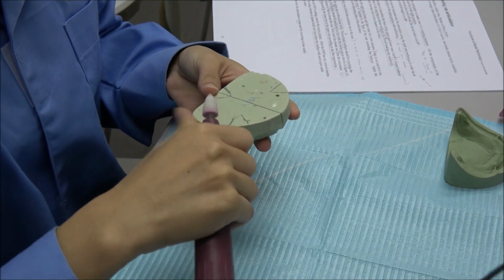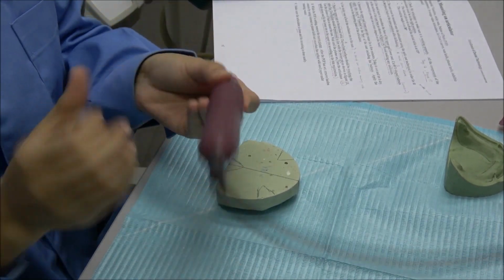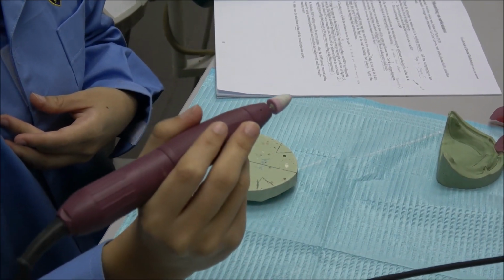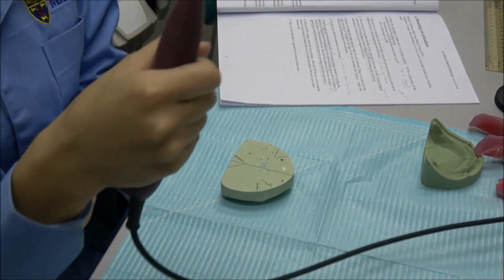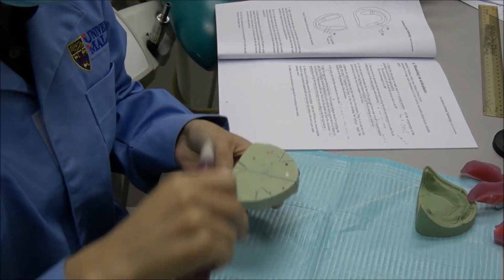the line we draw, and then you hold your handpiece like this. And then I realize some of the students hold the handpiece like this. Please don't, because it's very dangerous. If we are just using a few fingers to hold it, it is unsafe. So make sure you hold your handpiece like this. Okay, we start trimming now.